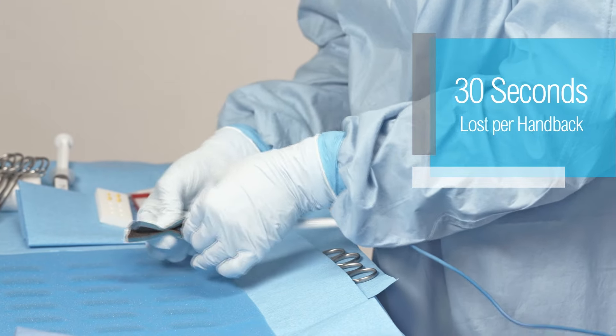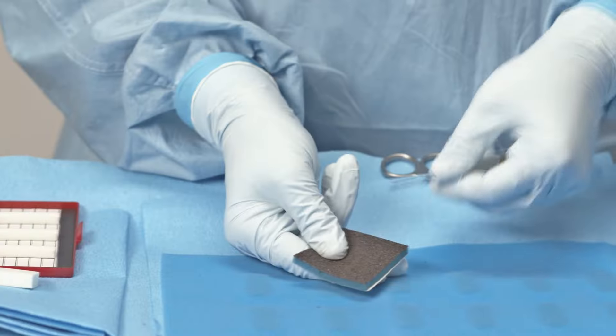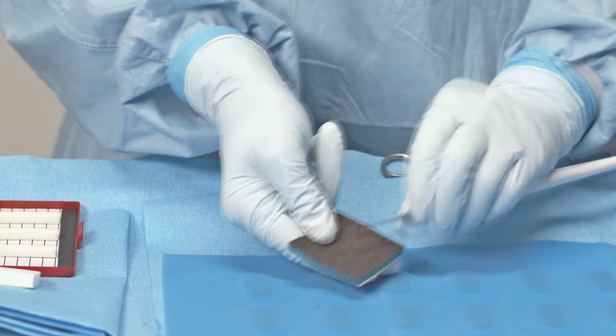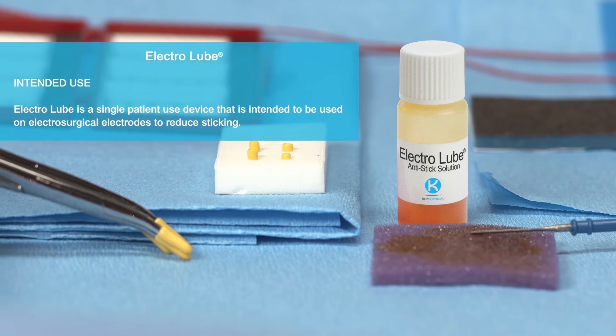With an average of 30 seconds needed for each handback for cleaning the instrument, avoiding these procedural disruptions may lead to a meaningful benefit in terms of OR efficiency.